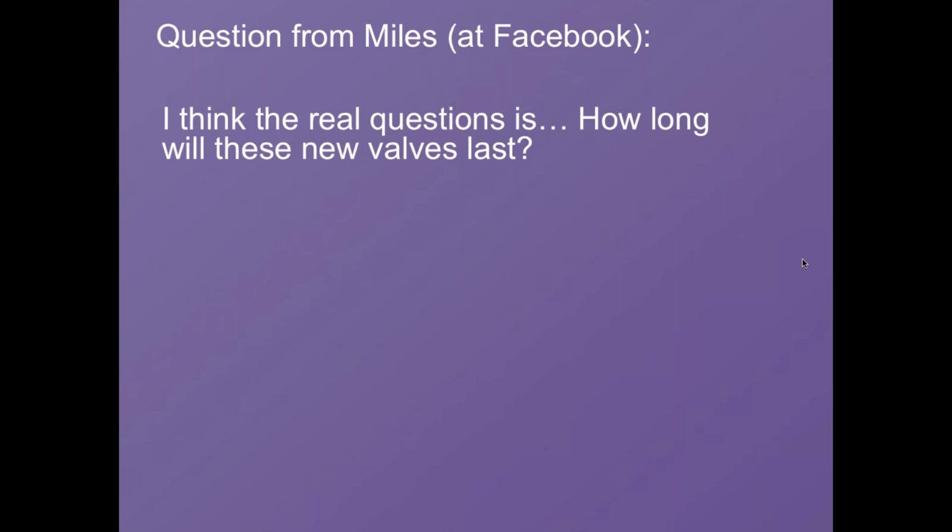In these studies, we'll look at 1 year or 2 years. Patients are often randomized to one treatment, which would be the standard therapy for those patients, versus the new investigational therapy. Then we look at what their outcomes are in the short term and in the long term. Sometimes studies are done as a clinical trial registry, like some of this valve-in-valve work we talked about, where the FDA has agreed that if you can show safety and efficacy without randomizing to a control group, they would also potentially be willing to approve it.